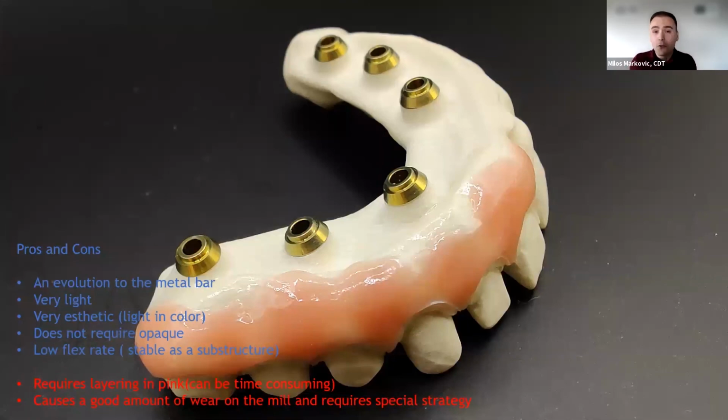The pros and cons: it's an evolution of the metal bar. So that's great. We don't want to be doing any more anodizing of the bars and then opaquing them and doing all these different things. When I worked at Nobel Biocare, that was a big part of what we did. We did it well, but it was very time consuming and it could be problematic if it's not done right. So it's a very light material, very aesthetic, light in color, does not require opaque, and it has a low flex rate, which is a stable substructure. The cons: it obviously requires layering in pink, which can be a bit time consuming, but so is everything in a dental lab, right? And like I said, it causes a good amount of wear on the milling unit.